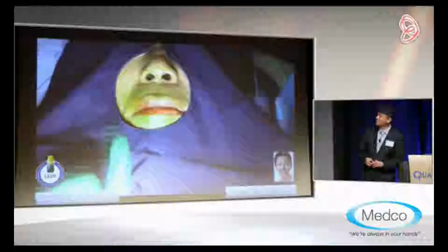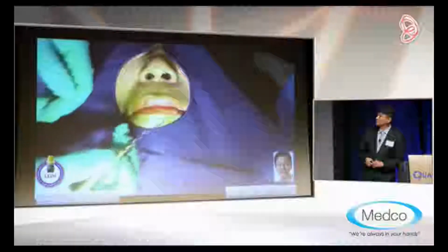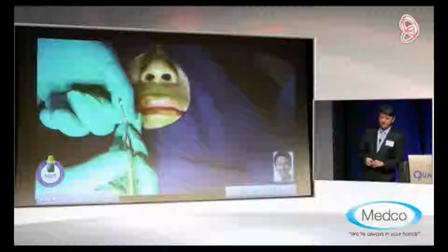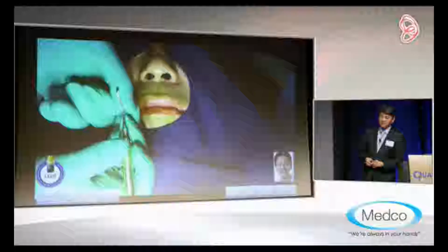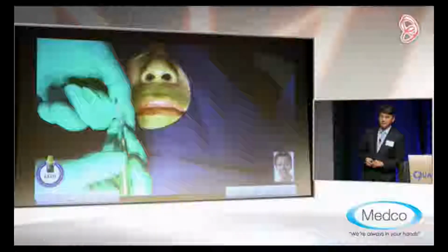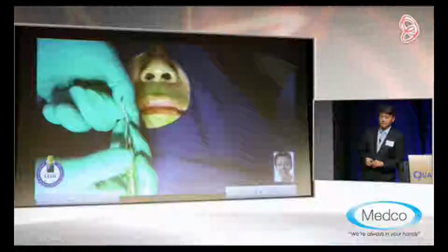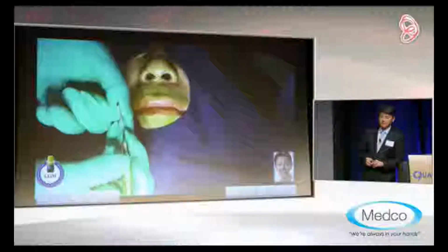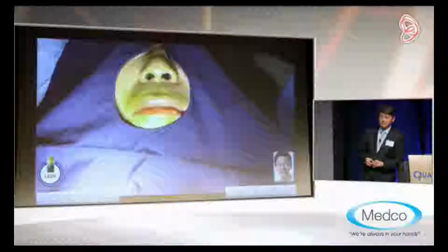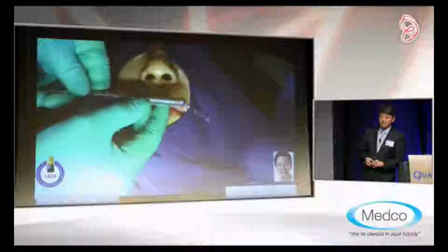And afterwards, it's impossible to do decortication to accept bone. So we made this special curette where you can go inside the tunnel to curette all the periosteum. And by doing this, you prepare your site so that it can accept the recipient bone. And then we have this blade where you can change the angulation of the blade.